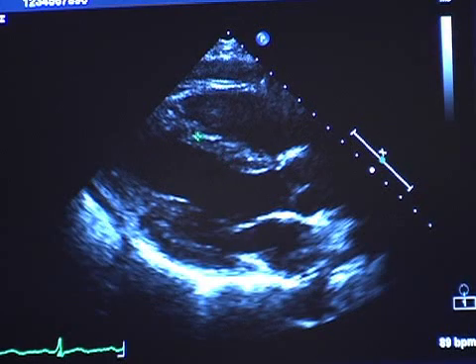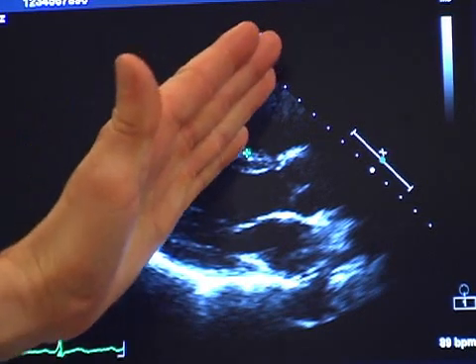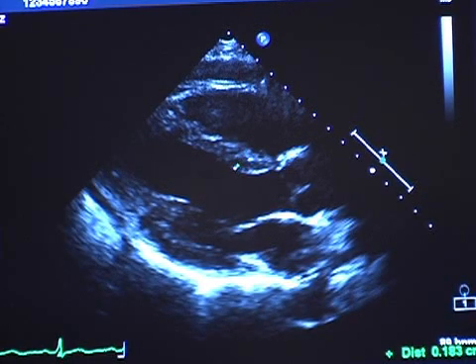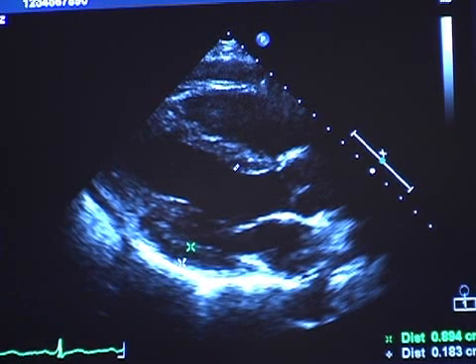Bring up your calipers. I like to follow the wall, making sure you don't cut into the RV wall or the moderator band. You want to imagine a perpendicular line just below the mitral valve leaflets — it should be a continuous line. Measure to the edge of the septum; here we get 1.0 centimeters. Then you want to measure the posterior wall as well. I follow the posterior wall and measure until the wall ends — you can see the pericardium there. I got 0.9 centimeters. So it's 1.0 septum and 0.9 posterior wall, which is well within normal.